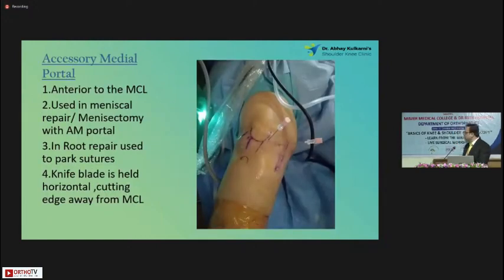Now we come to the accessory middle portal. This is the MCL marking and that's the anteromedial portal. It is around two to 2.5 centimeters medial, but that is not fixed — you should decide when you do an arthroscopy. An important point here is that you should not injure the MCL. So take a needle and mark your point from inside where you have to make it.